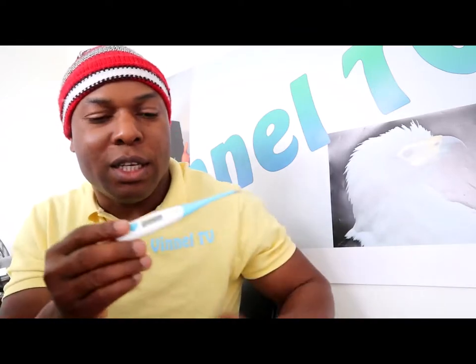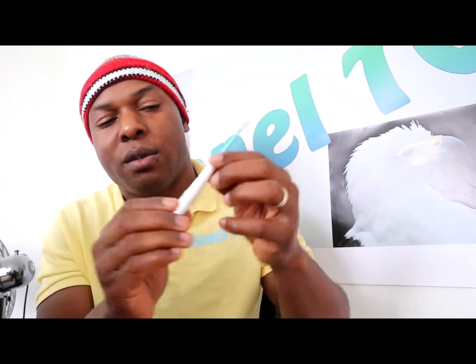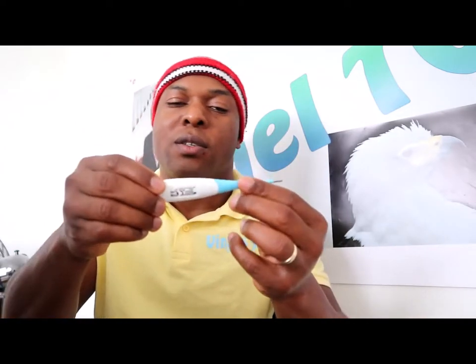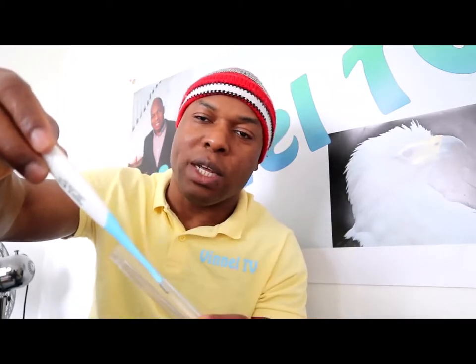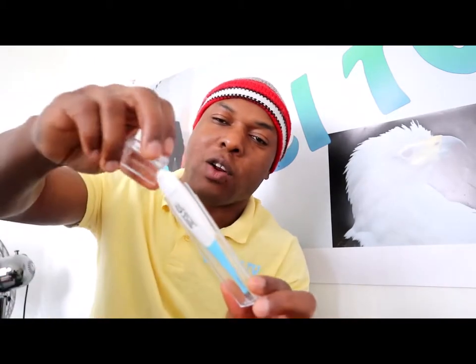Now the reading is out, it is showing 35 degrees on this one. So once it's done, you will hear the sound. Okay, so you hear the sound when it is done. So guys, to put this back, you need to clean this, wipe it with clean clothing or clean towel paper, and put it back into the container and close this.